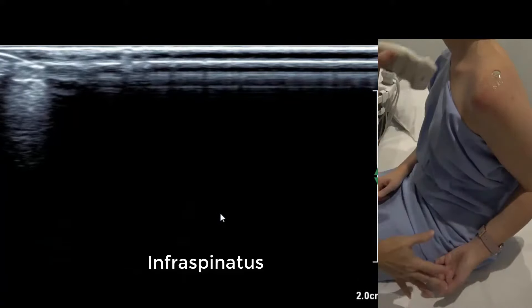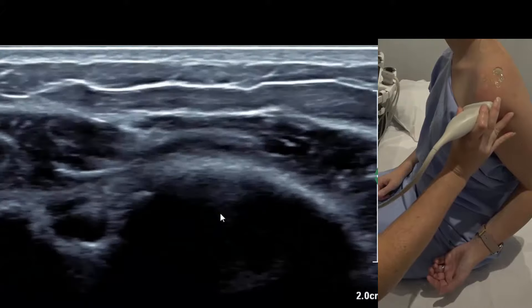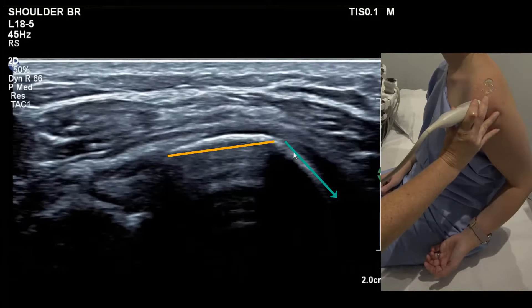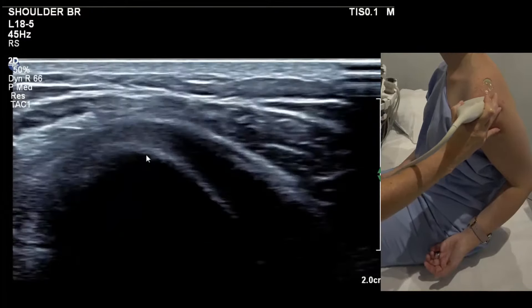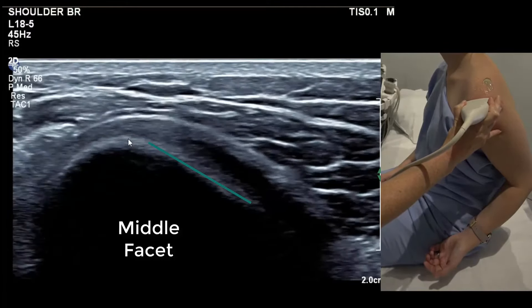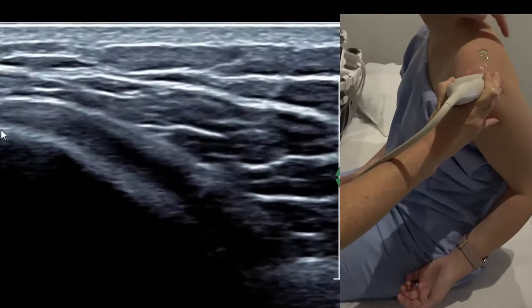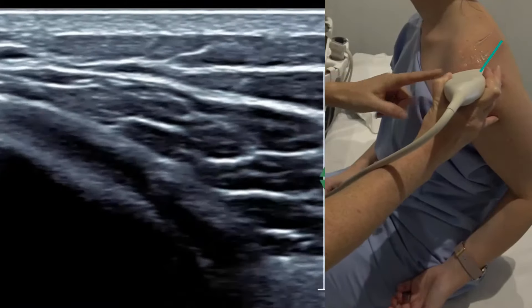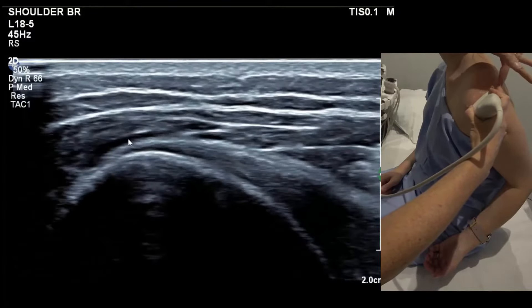To do infraspinatus, don't change anything — just come back to the sleeve view and run up until you see the change in facet. There is the transition point from supraspinatus to infraspinatus. Move that little bony point to the left of the screen. The tendon you're now seeing is infraspinatus in transverse. It looks a bit hypoechoic, so we rotate the camera a few degrees anti-clockwise to line up with where the infraspinatus muscle belly comes from.